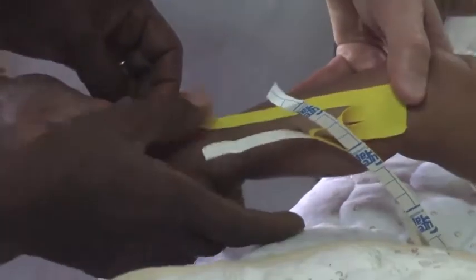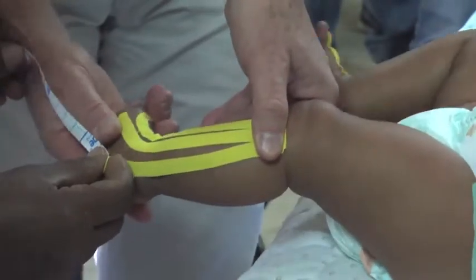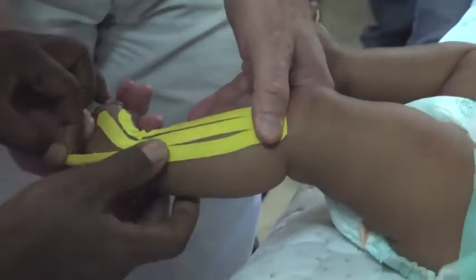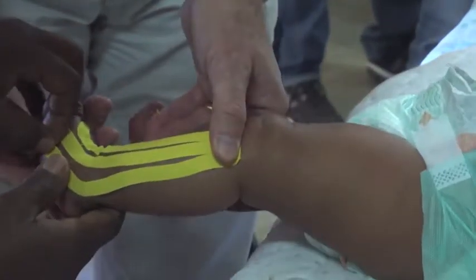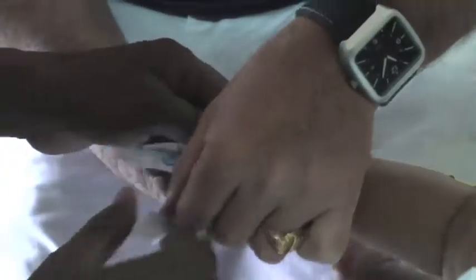Very good. Stick up here. Very good. And then do this side. And stick better. And stretch the skin. So take off the paper up until where it divides. Hold on here. And then, no tension.